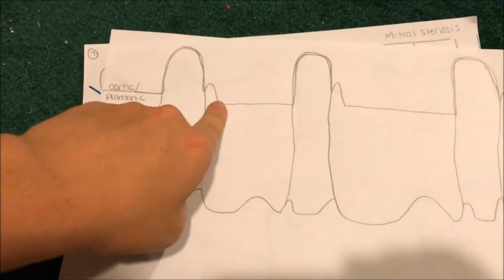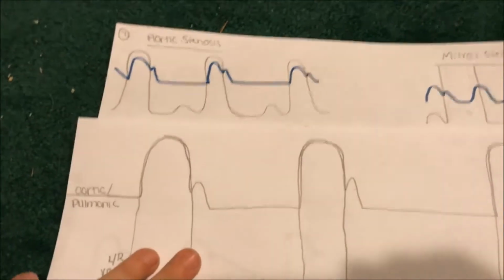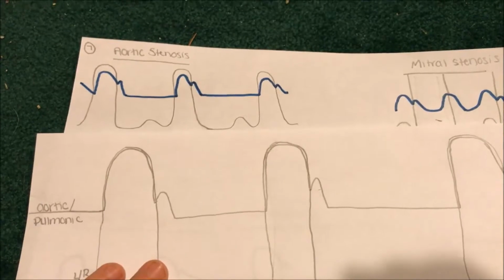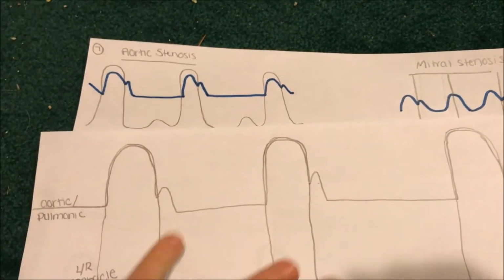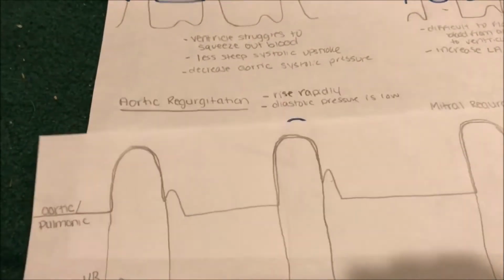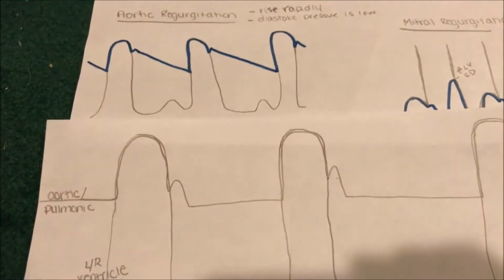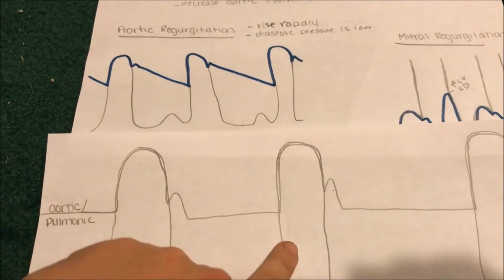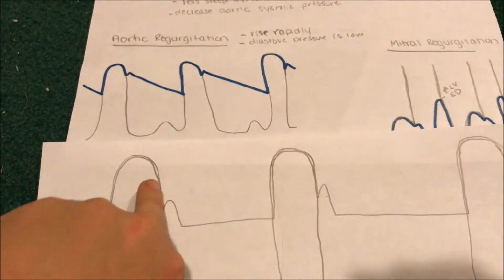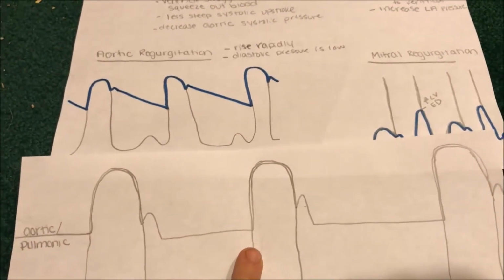Aortic, we showed you that it kind of levels off, which is good in that case for the aortic stenosis, minus the fact that it doesn't level off and become one common chamber because there's decreased pressure. Aortic regurgitation, it's going to show that there is a steep decline in blood because it's losing the blood back into the ventricle.